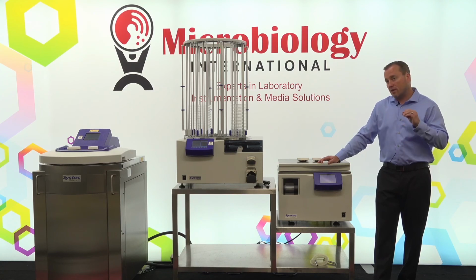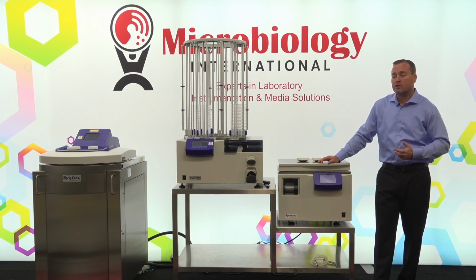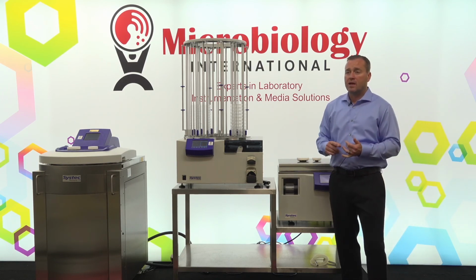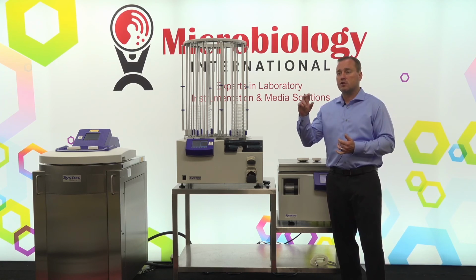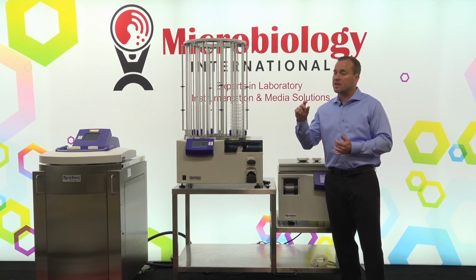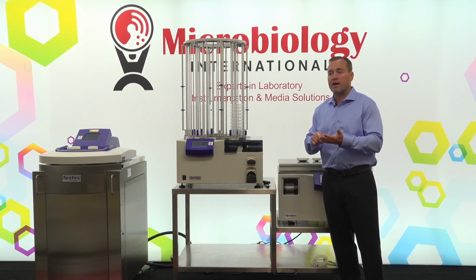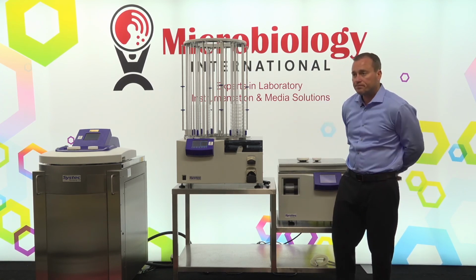Now, those 3 lines would be very tight, but if you want to put any programming in that printer of expiration date for a specific type of plate, then the message would know on this given day that we have 3 months available. Once those 3 months are surpassed, then it would just label that directly onto the plate for you.